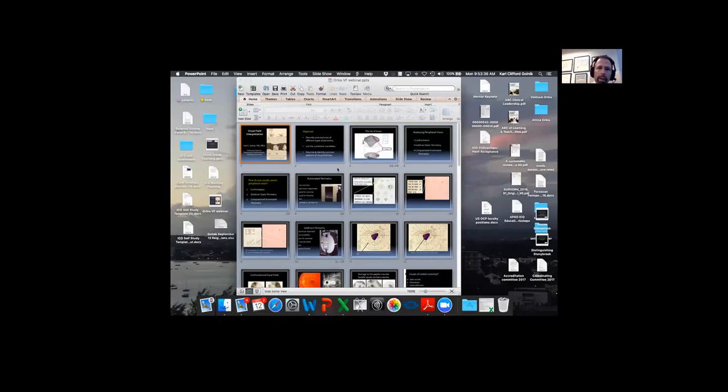Okay, here's a question. It says, do you use 10-2 Humphrey visual field in real practice as suggested for severe generalized depressed field? I use the 10-2, yes. There are a couple times that I'd use a 10-2. If you have someone, say, with end-stage glaucoma, or someone for whatever reason, they have very constricted visual fields, you're not getting any information from all the rest of the field, and you want to look centrally at the remaining field for change. So the 10-2 is going to give you more information with that remaining visual field. So that's one reason I use a 10-2.